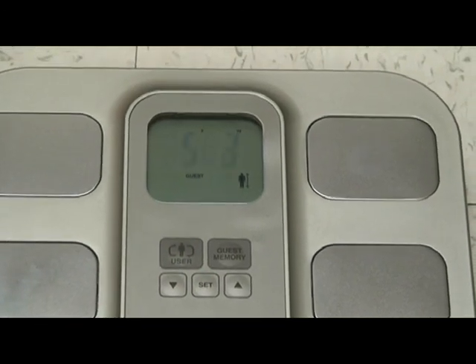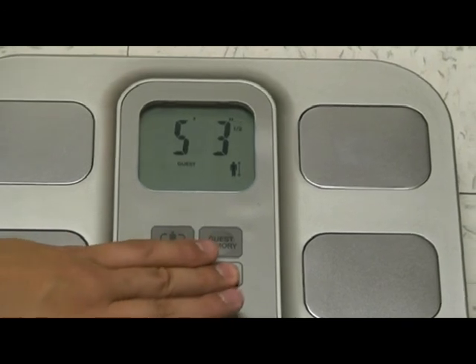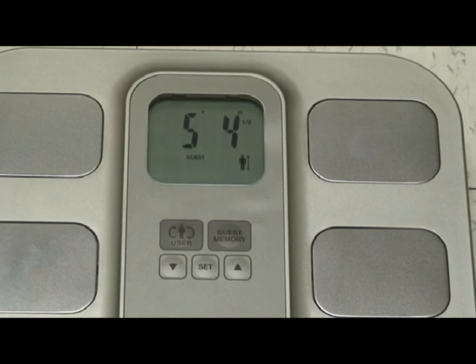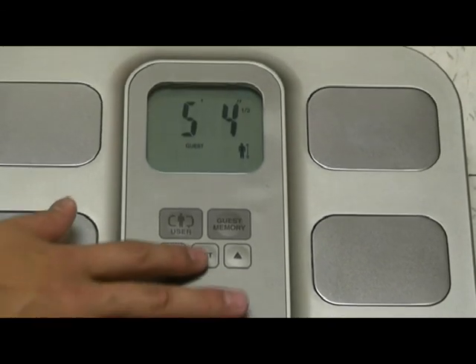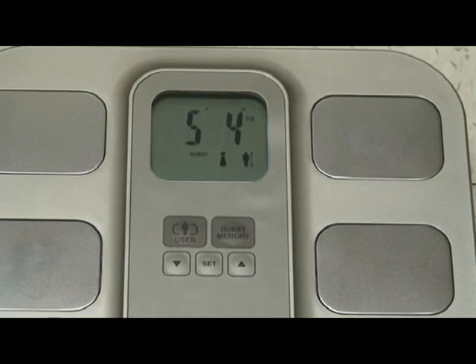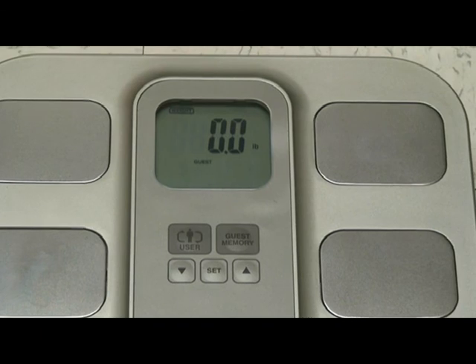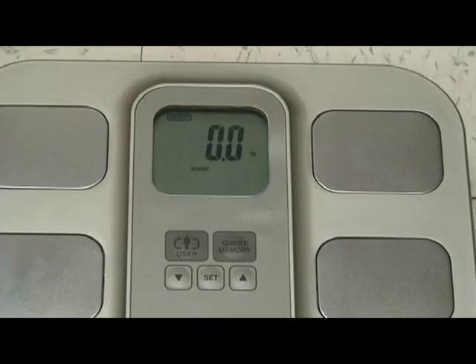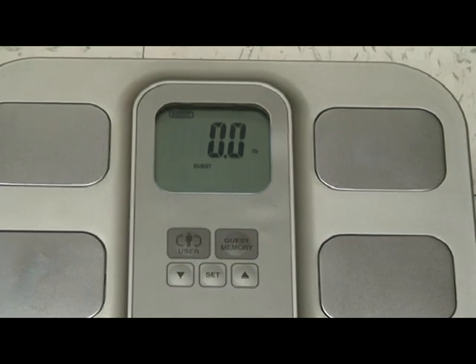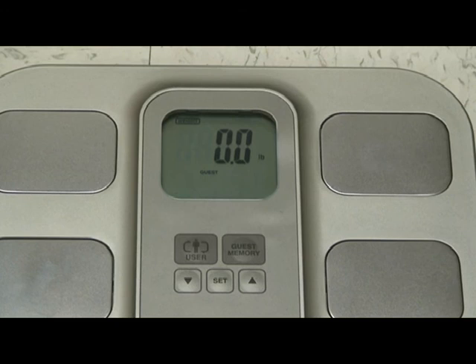And it asks you for the patient's height. You can ask the patient their height, or you can measure it using the tape meter provided for you. Then press set. Then you're going to wait about 2 seconds. It should show count. You're going to have the patient step on the scale without any shoes or any socks, bare feet. And once they step on the scale, it should give a reading for the BMI and percent body fat.